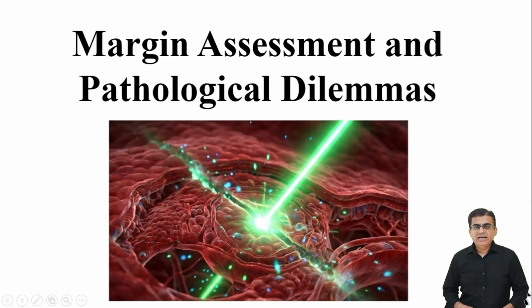Over the next 12 slides, we will discuss margin assessment in TLM. We will look at the common pathology problems and the reality of micro margins in early glottic cancer. As a laser surgeon, you must know that your job does not end when the surgery is over. Your surgery is truly complete only when your visible findings in the operating room match the final pathology report.